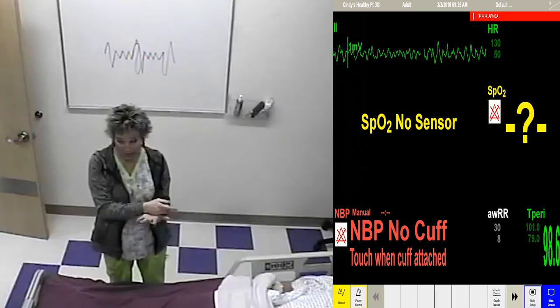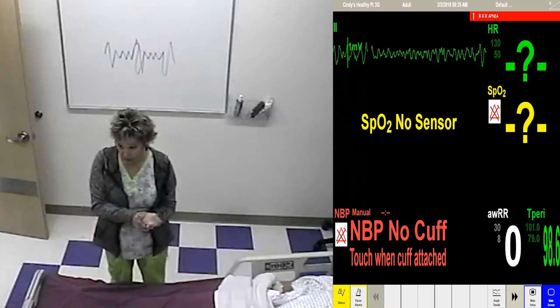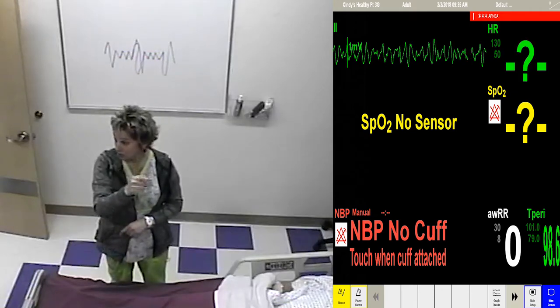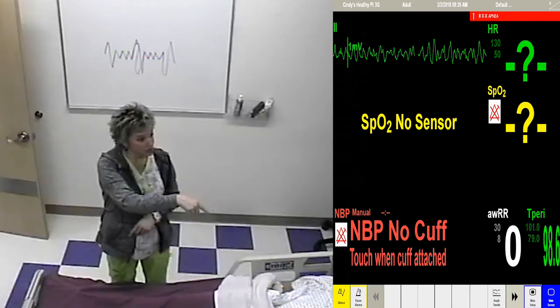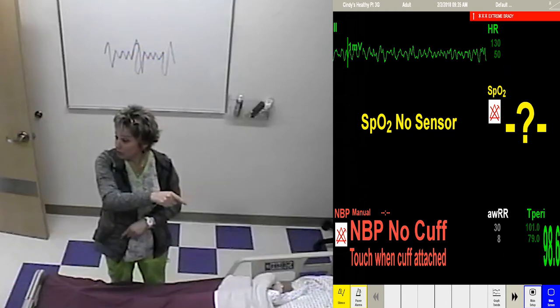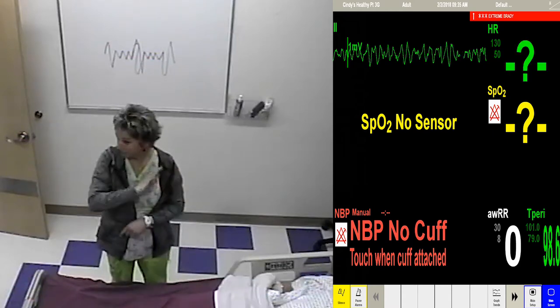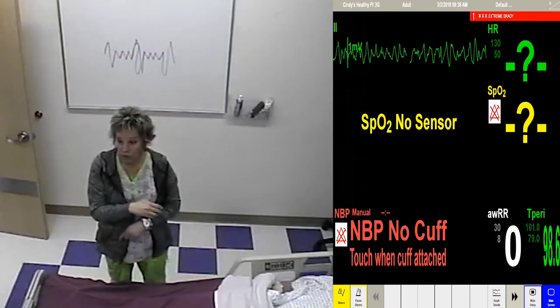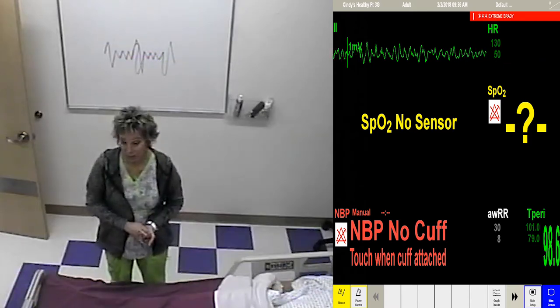Okay. Is this patient alive or dead? They're totally dead. When you coded your patient this week, this was the rhythm that your patient was in. Ventricular fibrillation. If I had the blood pressure right now, what would it be? Zero. What's the respiratory rate? Zero. If you feel for a pulse right now, you got nothing. So this guy is as dead can be. We always think of asystole, a flat line, as dead, but this is just the same dead.